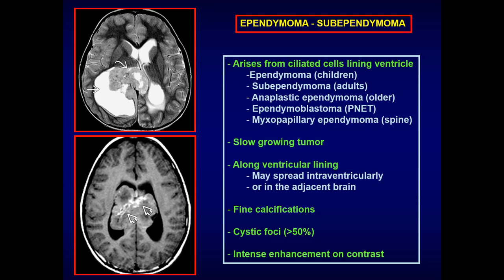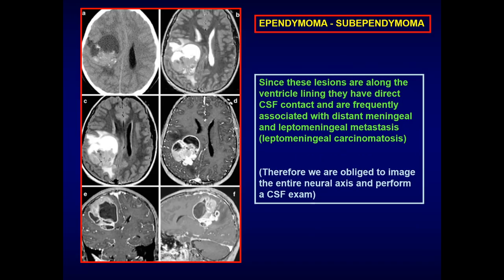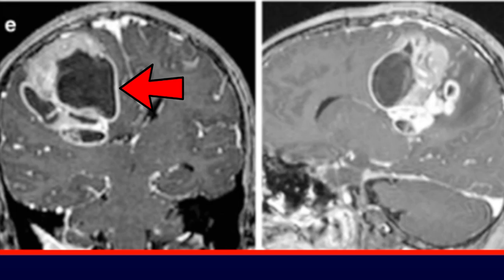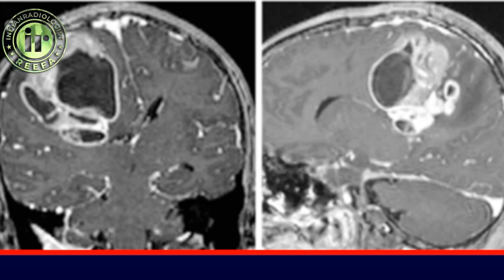Here is a case of ependymoma — a pretty aggressive neoplasm with a solid-cystic component and intense enhancement. Another case projects into the brain parenchyma with a solid and cystic component and intense enhancement of the solid component. Importantly, the periphery of the cyst is also enhancing, meaning the cyst itself is part of the neoplasm — unlike hemangioblastoma or juvenile pilocytic astrocytoma where only the solid component is neoplastic. The surgeon must dissect both the cystic and solid components entirely.